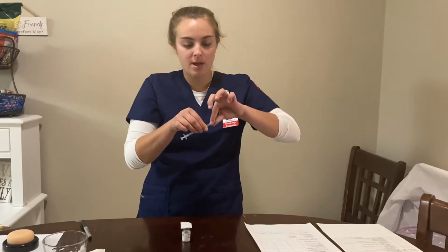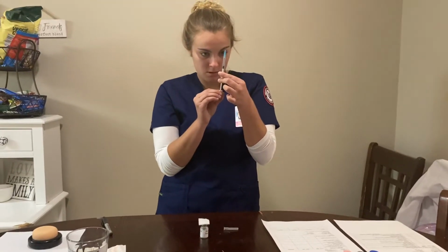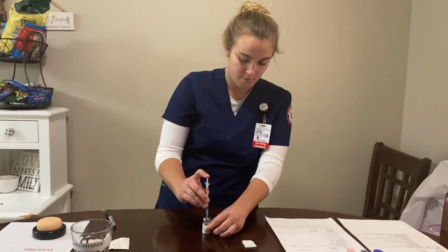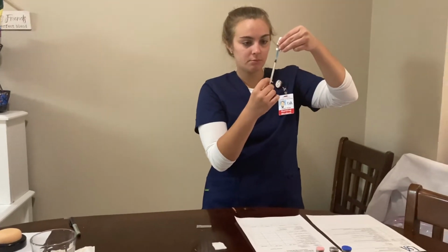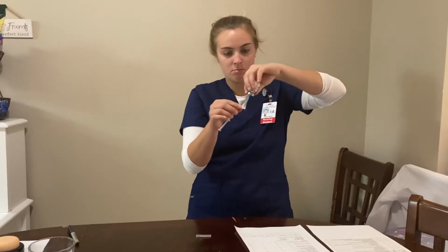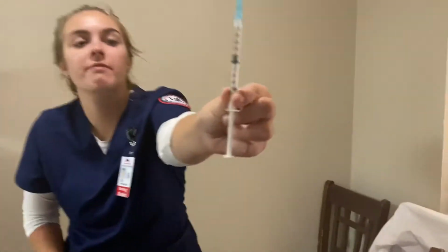I'm going to remove the cap, place it down. And I'm going to get 0.5 milliliters of air, so we reduce the amount of air bubbles, or hopefully none at all. And I'm going to put this in my vial and put the 0.5 milliliters of air. And then get to my correct medication. So 0.5 milliliters of heparin. Okay, so I have 0.5 milliliters.